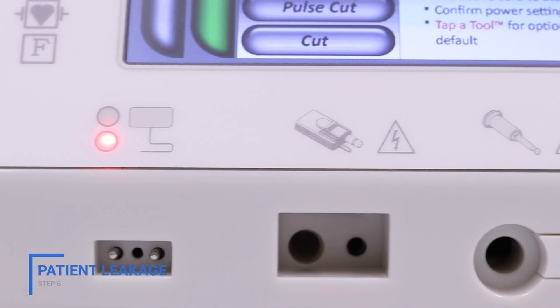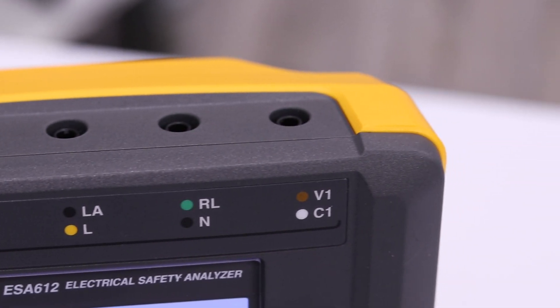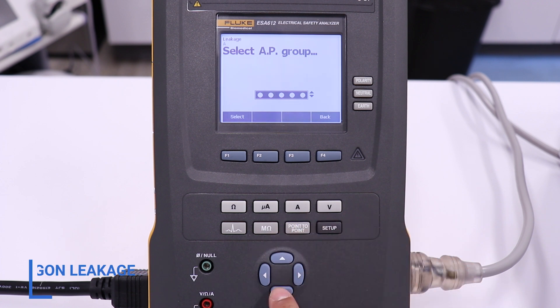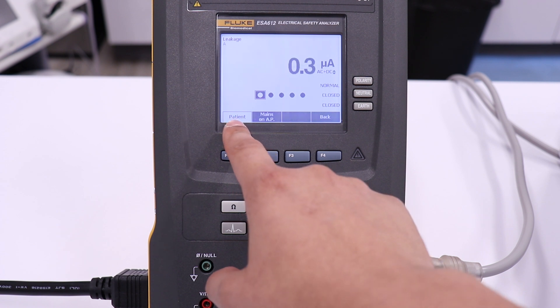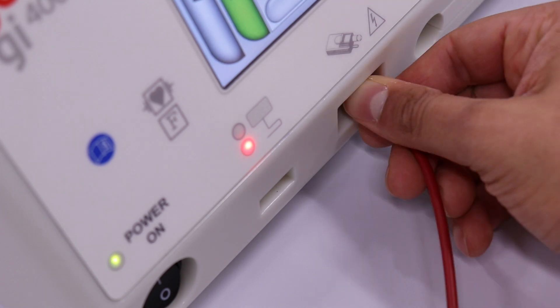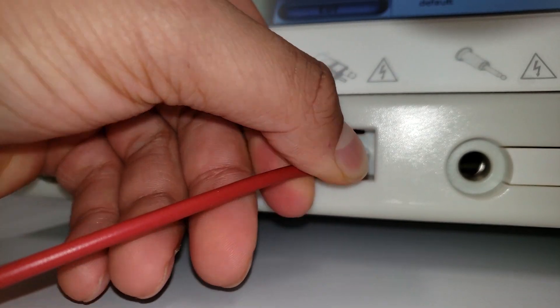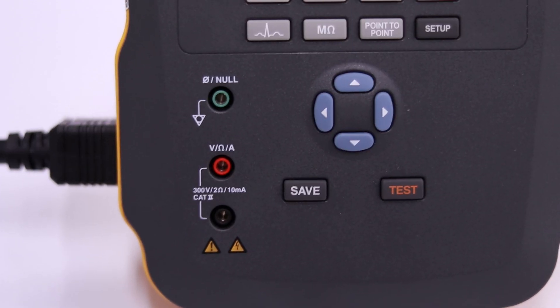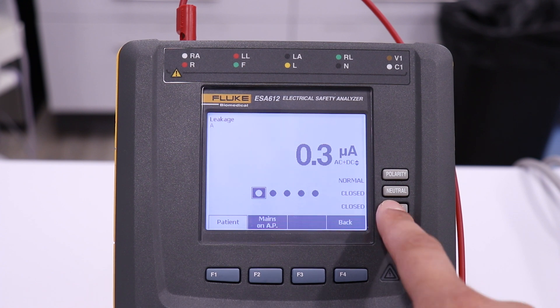Patient leakage testing is performed using the receptacles on the top of the ESA. To enter the patient leakage mode on the ESA, press the F4 button to select more from the leakage menu. Press the down arrow key to select the first applied parts group, then press F1 to select. We will use the right port of the argon receptacle for electrical connection to the GI-4000. Plug a 4mm test lead into the far left receptacle on the ESA. Test for normal polarity, closed neutral condition, and single fault, open earth condition.